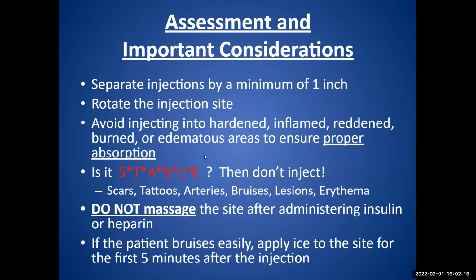Okay, this is my little acronym here. STABLE. Okay, so look for scars, tattoos, arteries, bruises, lesions, and erythema, which is what? Basically just redness. Okay, so if it's not stable, then don't inject there, right?